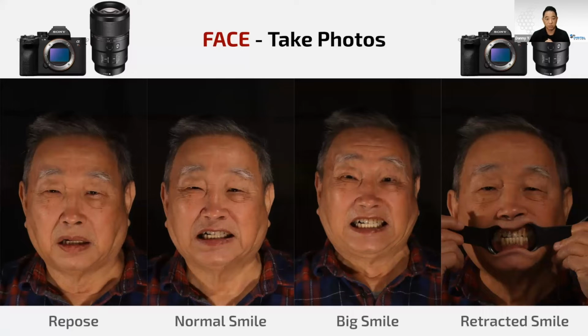We want to make sure the patient is looking straight at us, their eyes are open, their chin is up, everything is easy for us to align, and we want to capture these photos ideally on a tripod if we can, but if not, we want to capture them from the same position, from the same distance, so they're very similar to each other, so that we can overlap these photos very easily.